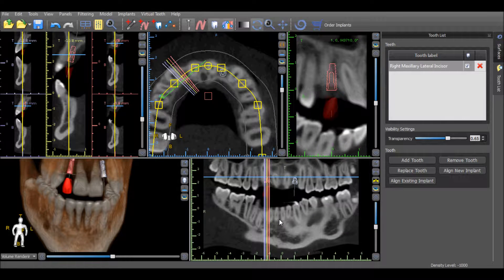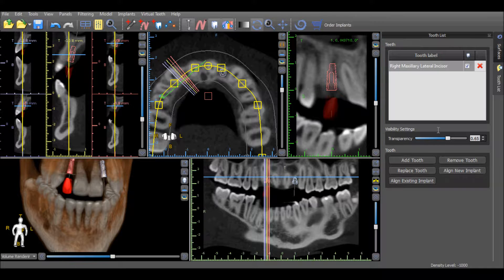The transparency of the tooth can be changed by using the Transparency slider. A tooth can be removed by selecting Remove Tooth or by pressing the red X next to the listed tooth.